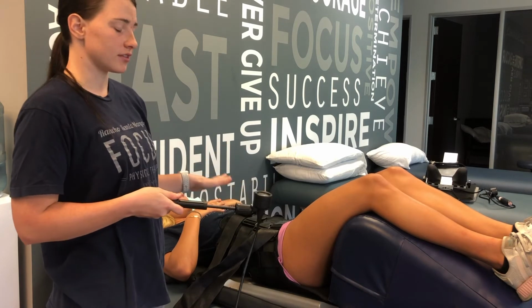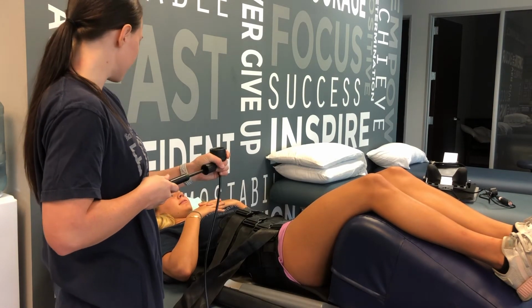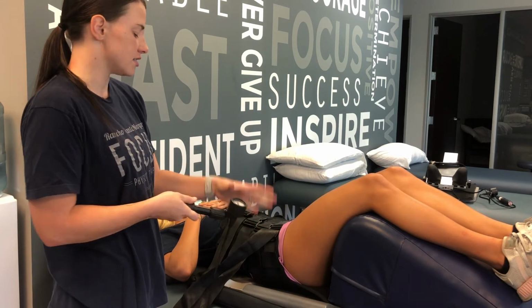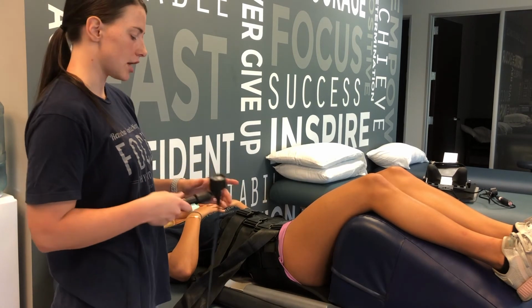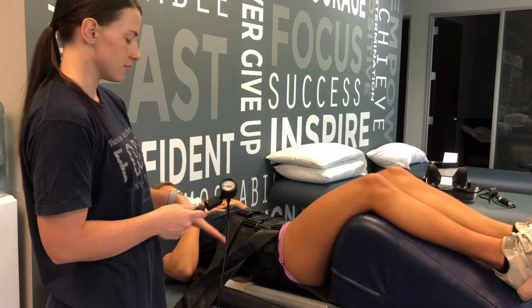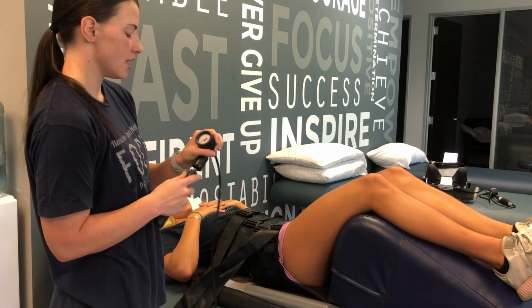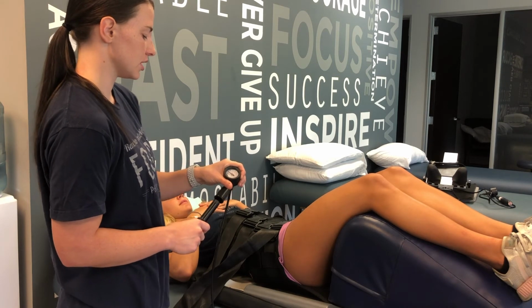Sometimes if they feel like they're sliding down, you need to tighten the straps a little bit more. Does it feel like it's pulling? Mm-hmm. A little bit? Good. And then, same thing with the cervical traction, we want to start out first with just a moderate stretch. You don't want to push it to the max for the first time, and then we're going to lock it to the left. We'll leave them for the 5 minutes or however long the therapist has instructed, and then we will turn it to the right to release it.